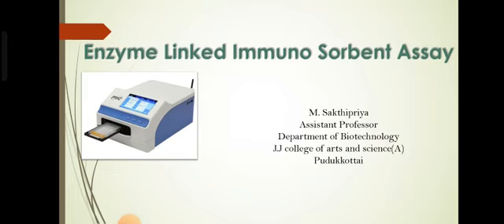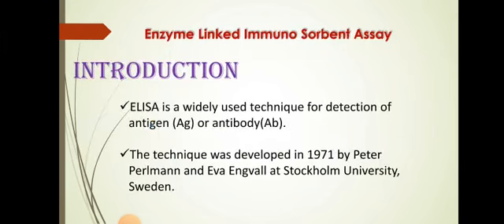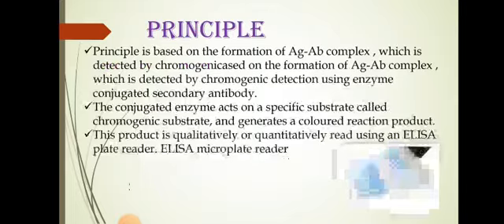Today we discuss the topic of ELISA, enzyme linked immunosorbent assay. The introduction of this assay is to detect the antibody or antigen present in the sample. This technique was developed by Peter Perlmann and Eva Engvall in the year 1971 in Sweden.